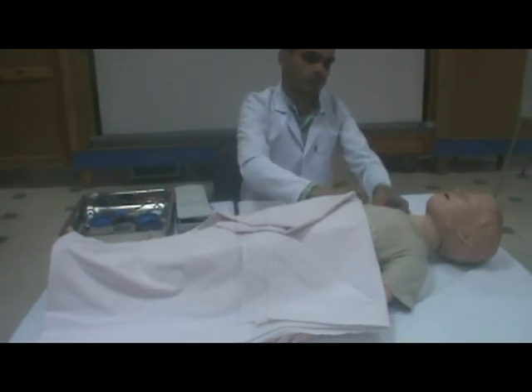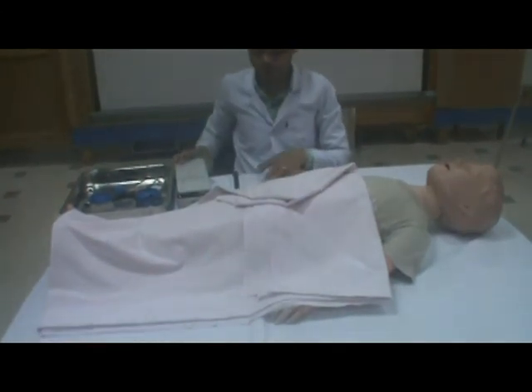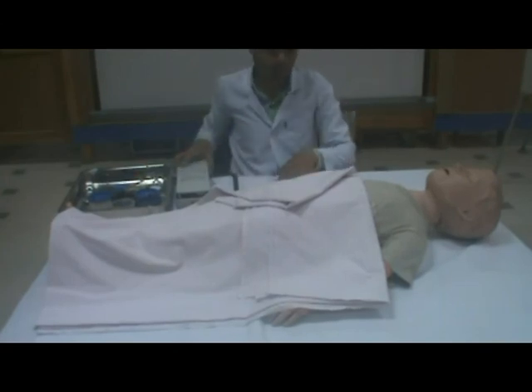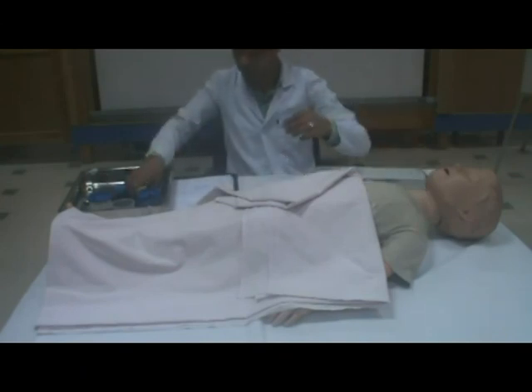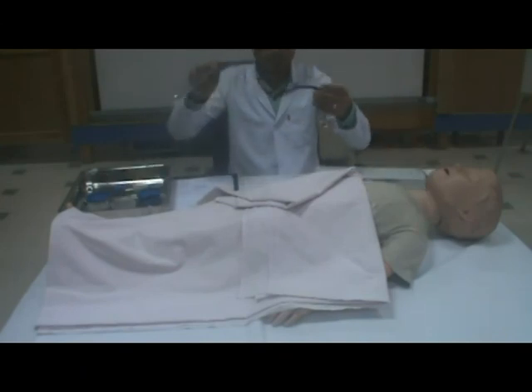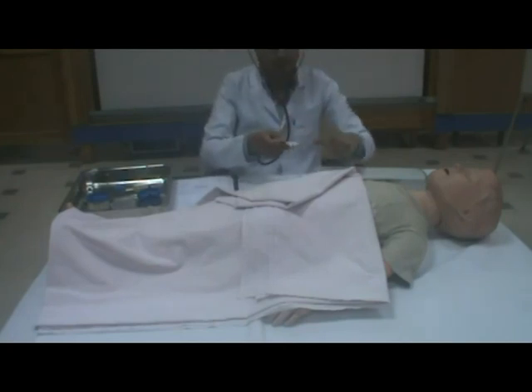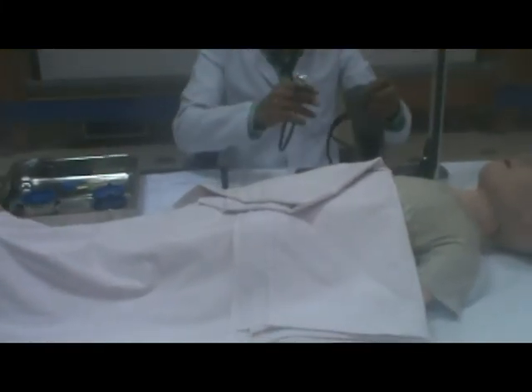Expose the site of measurement fully by removing any constricting clothes to ensure proper cuff application. Position the limb at the level of the heart to prevent false reading. Place stethoscope earpieces in ears and be sure sounds are clear, not muffled, as each earpiece should follow the angle of the ear canal to facilitate hearing.